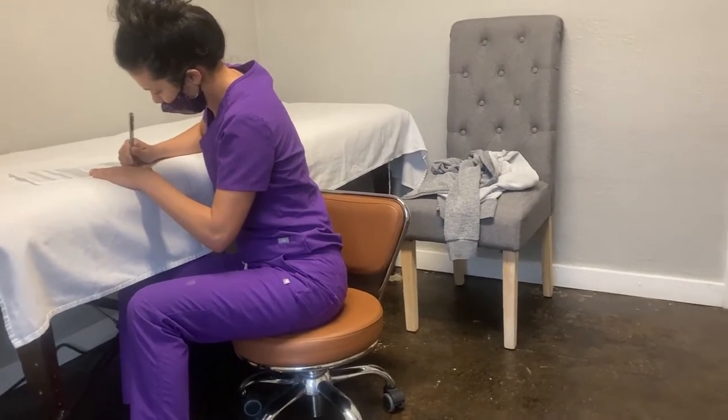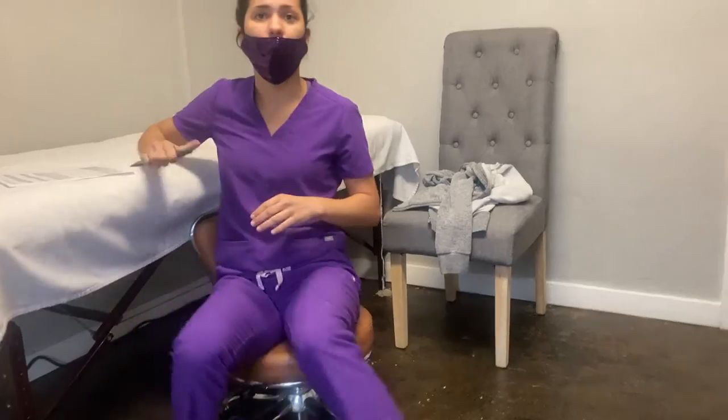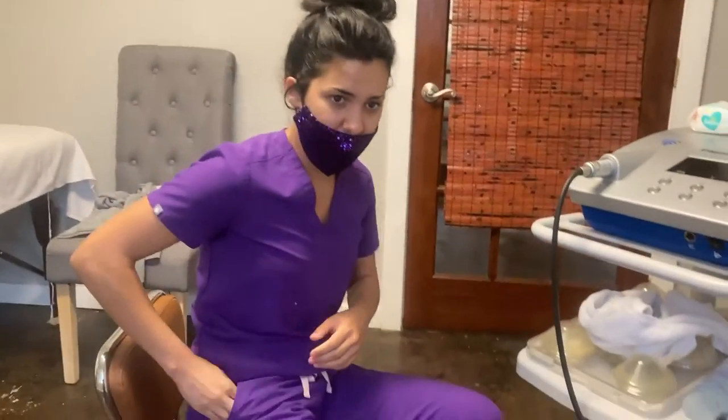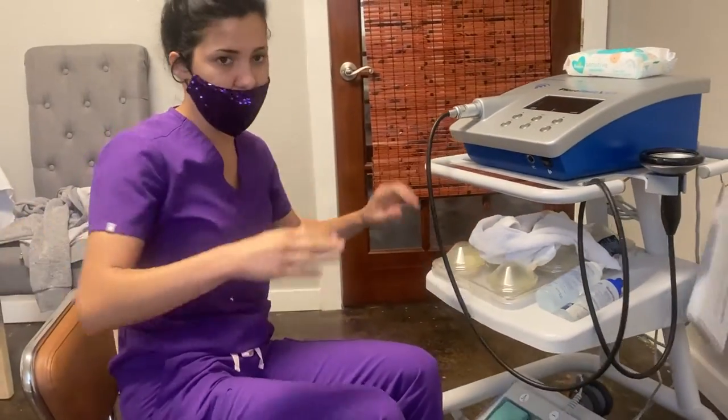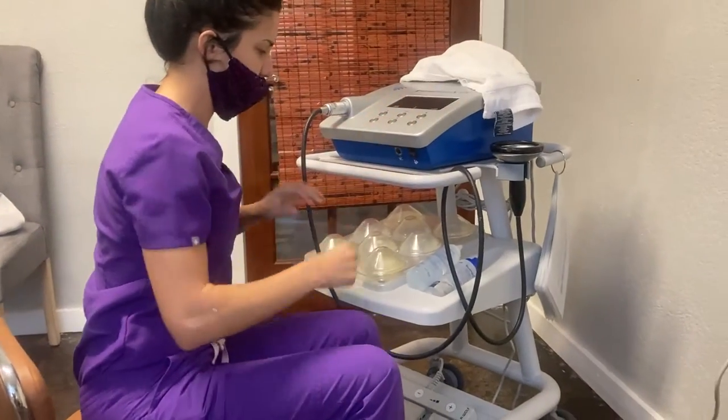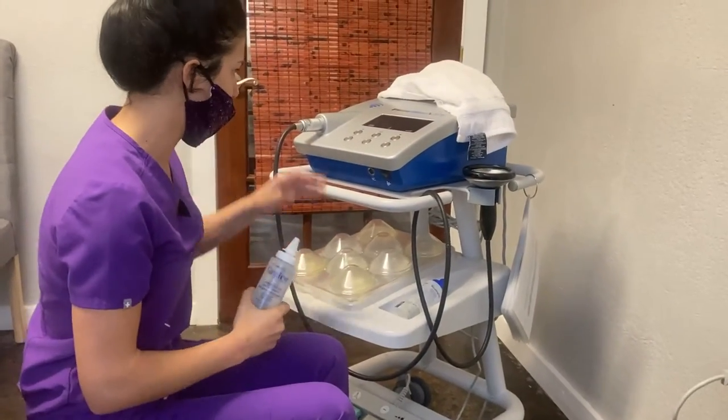Another thing that wasn't on our menu was shockwave therapy — whoever heard of that, right? Shockwave therapy is for sending sound waves into that joint. I've done this to myself and I'm going to control the power based on how she reacts to me. We can just alter it based on what she thinks about it. It's been very interesting.